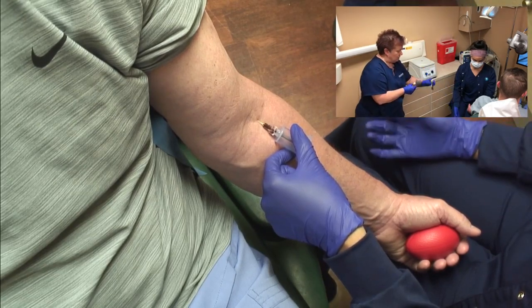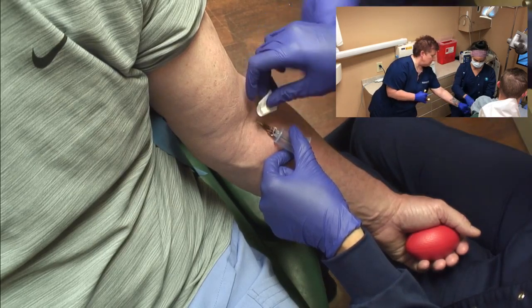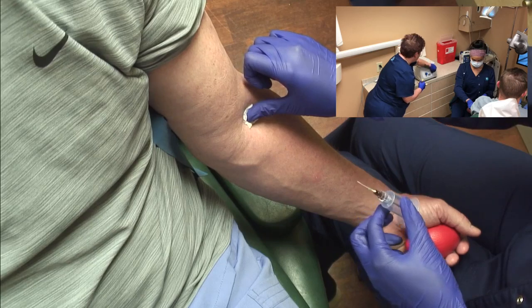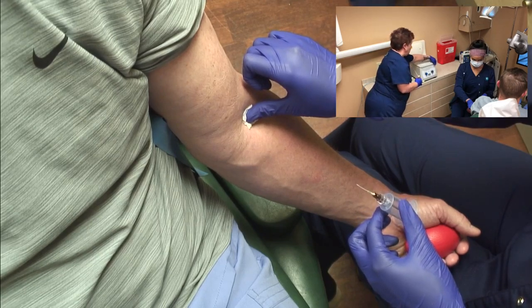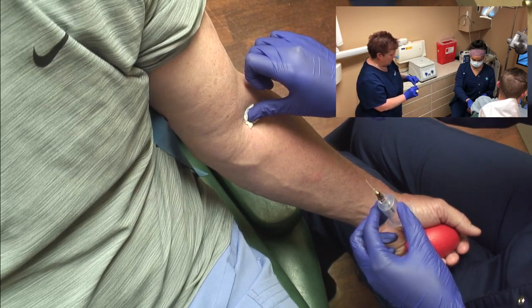This is going to twist. Now China will then use a 2x2 and apply pressure. I'm going to open this up, shut it off. There's a button over here to open. You've got to wait till it stops. While I'm waiting for that, I'm going to give China the Band-Aid here.